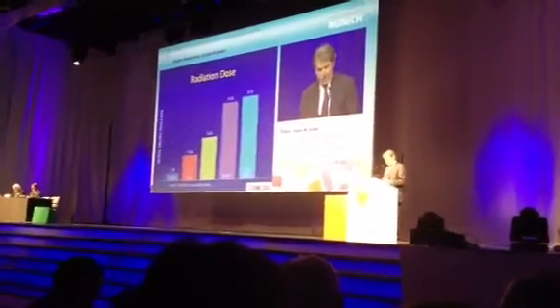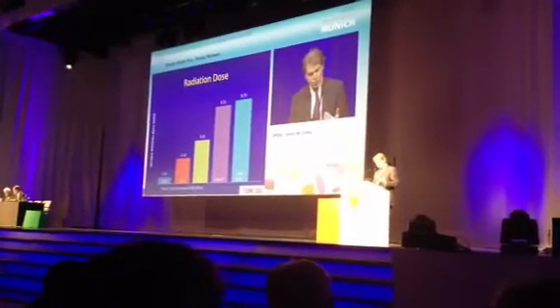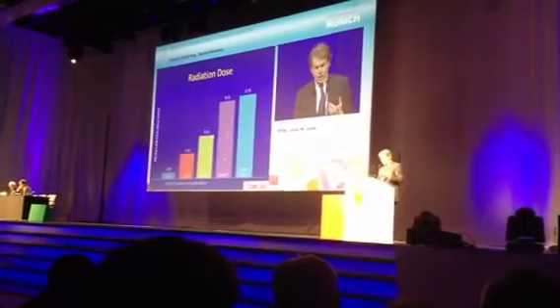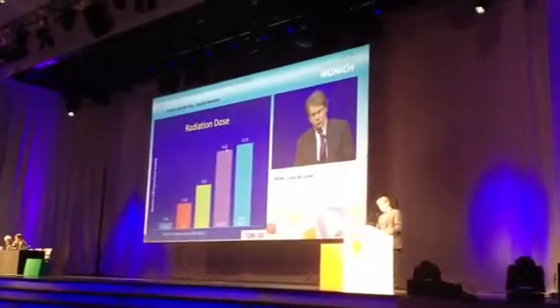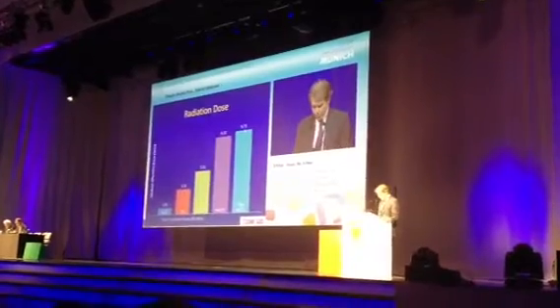And finally, in terms of radiation, I show here radiation for the calcium score, for the CTA, for the CTP. In total, the CT study, the radiation in terms of millisieverts was 9.3, and for the SPECT study was 9.7.